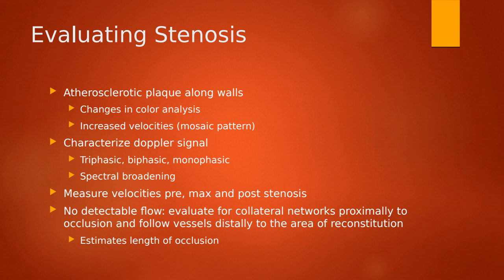We want to show that there's no color flow, that there's no waveform when we Doppler it, but we're also going to be looking to see if there's any obvious collateral pathway that formed in response to that occlusion. So we're looking around, problem solving, seeing where that blood is being rerouted to.